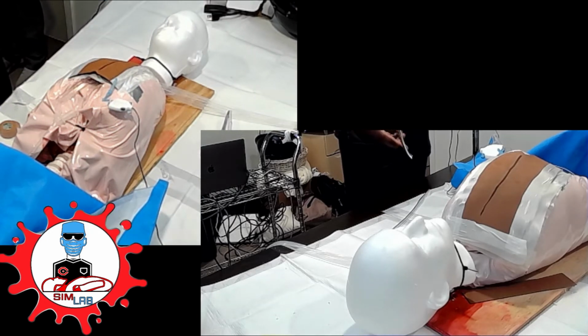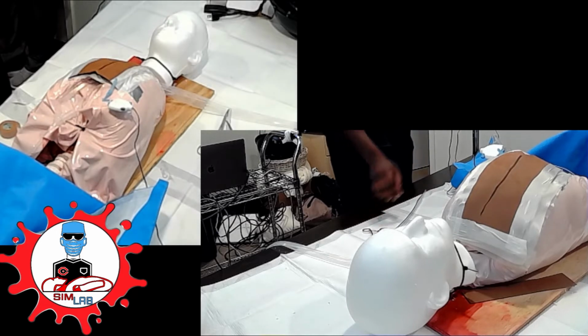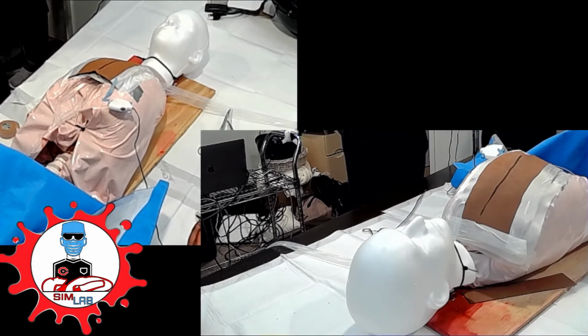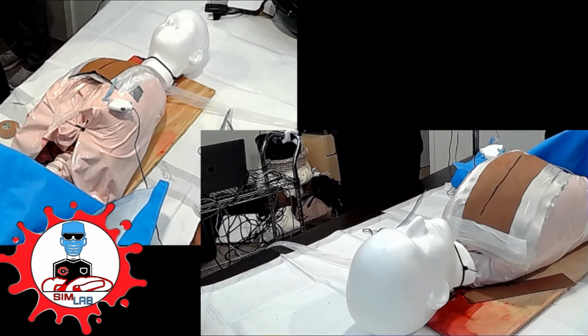While we take a minute to get all of our tools, everyone's familiar with the heart cart. It has a nice stepwise progression of what you may need, right? All the way down. Now you have Impella purge cassettes on top. How do you get into it?